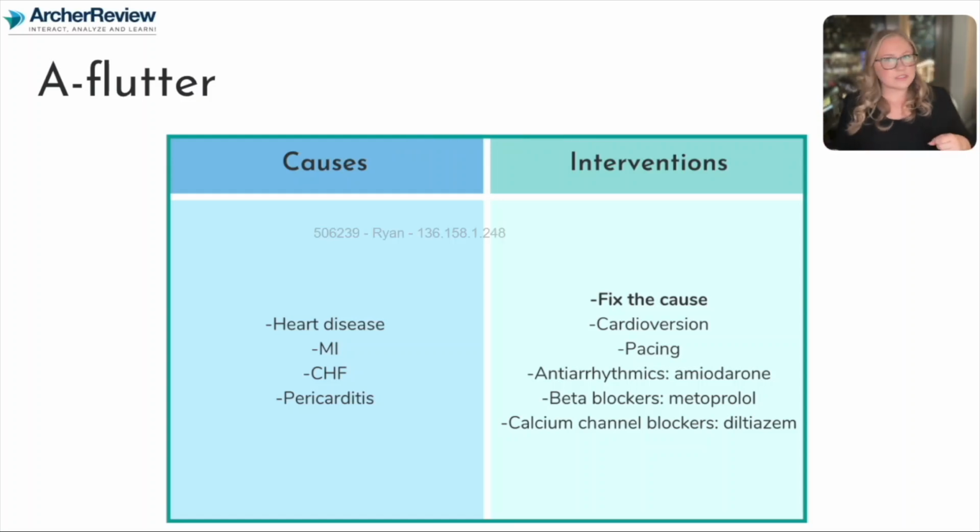Now, a lot of these clients are not going to have good cardiac output. So while we're trying to fix the cause here, what other interventions do we have up our sleeve to help? The first one is cardioversion. All right, we're going to get into the nitty-gritty about cardioversion versus defibrillation here in a minute. But to start us off, let's talk about what is cardioversion.